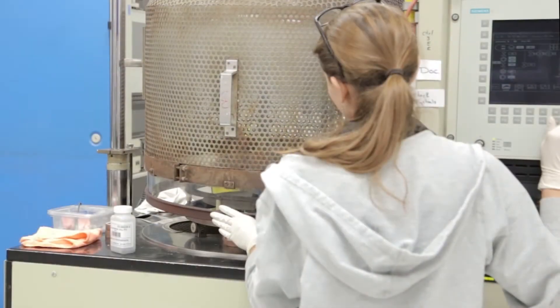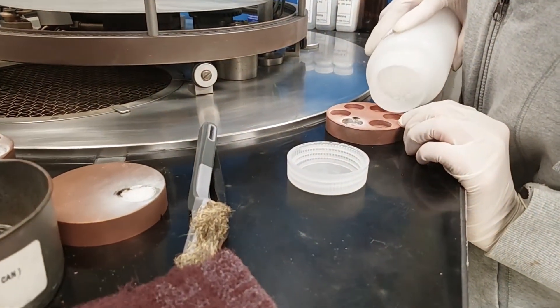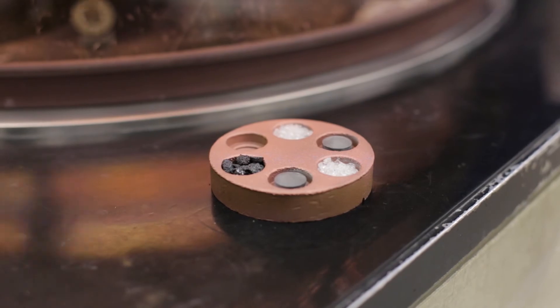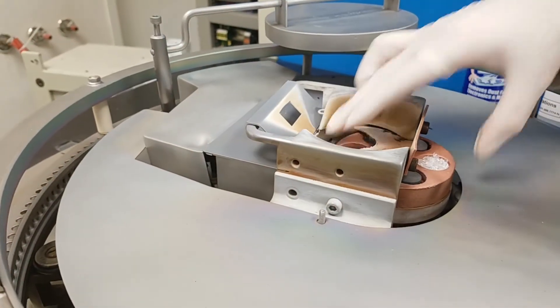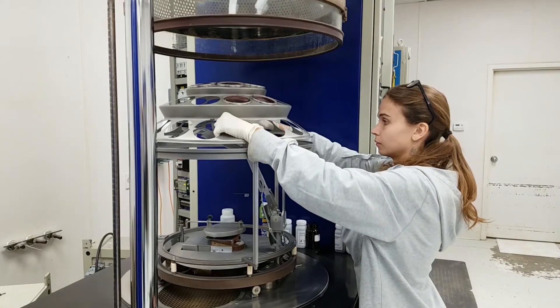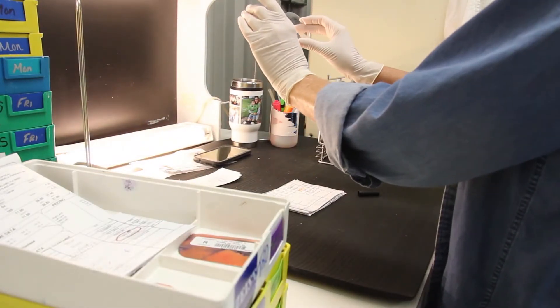The chamber is then reopened, and a new set of compounds are added to create the hydrophobic and no-slip powder coat layers. This requires 10 minutes per side, or an additional 20 minutes of process time. Once that is complete, the lenses can be removed, visually inspected, and then sent off to final inspection.